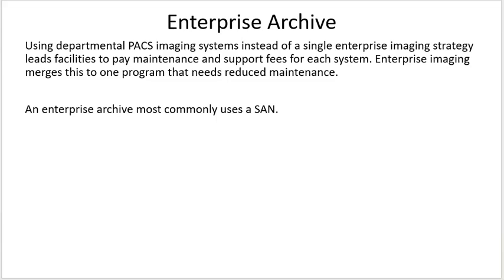What you should do is have one archive, call it an enterprise archive, and put all of the images created in your cardiology PACS, your radiology PACS, and your endoscopy PACS into one storage device.